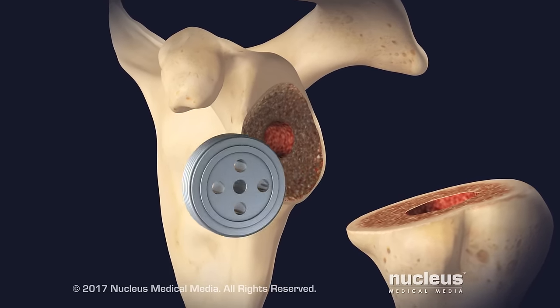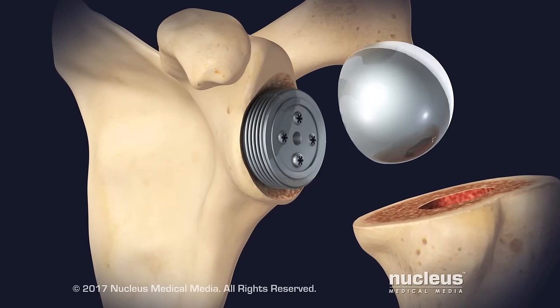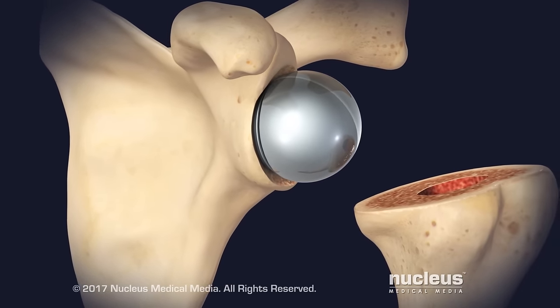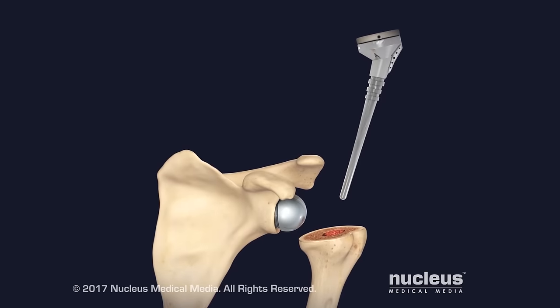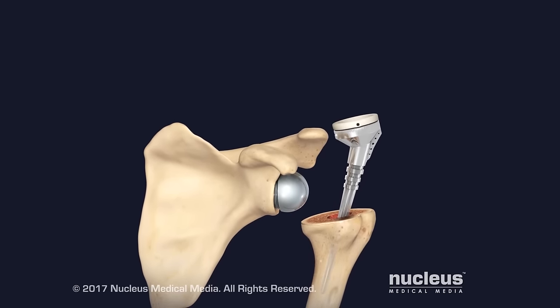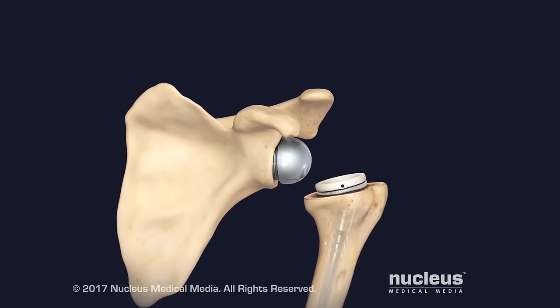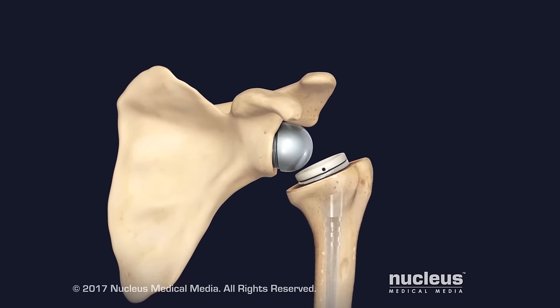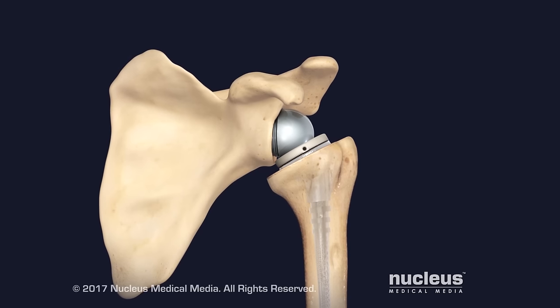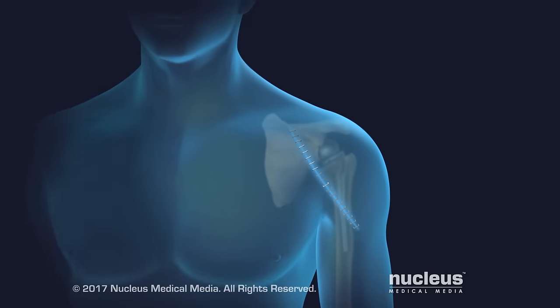A metal base will be attached to the scapula with screws, and the ball will be screwed onto the metal base. The socket implant is on a metal stem and will be inserted into the humerus. Finally, the surgeon will put the new joint together by inserting the ball implant into the socket implant. At the end of the procedure, the incision will be closed with stitches and staples.